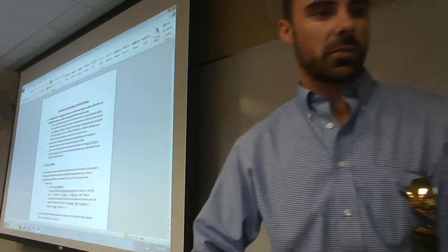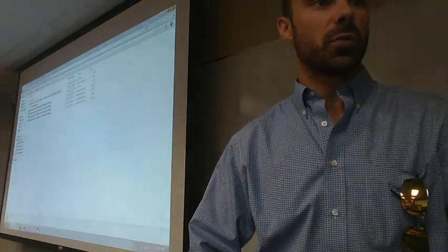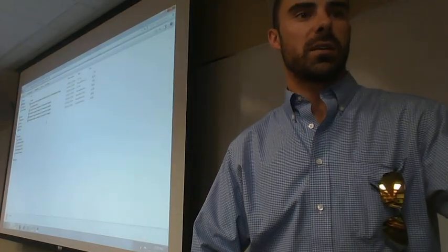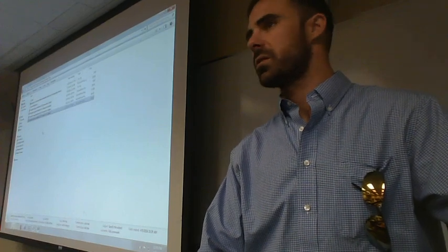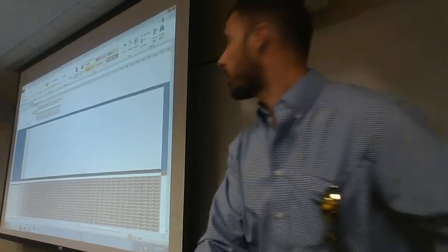And then what we'll do next is we'll open the Excel file of our range normalization template. Okay, so let's make sure that this has gotten done running. It looks like it has. So we're going to open that template. Now let's say I'm going to do it for 25 subjects. I'm pretty sure that's the number of people that we have. We'll sort that out. Okay, so this is our template.